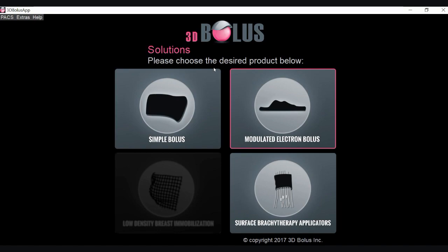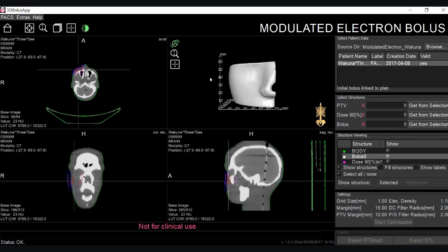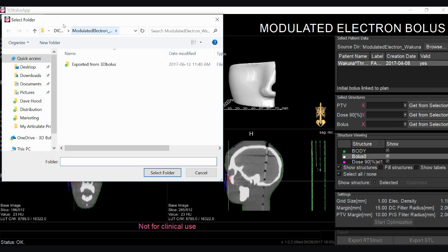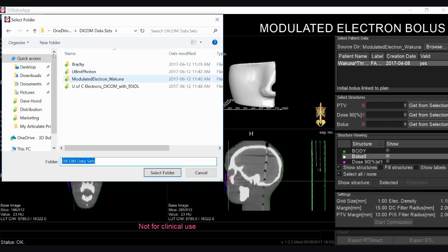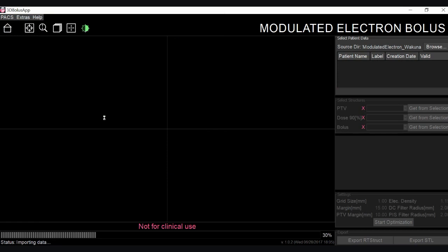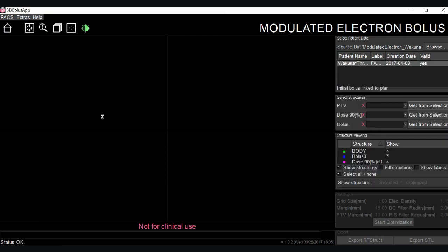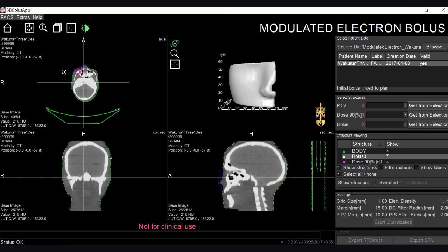Now let's take a look at the modulated electron bolus module, which allows users to reshape the bolus to allow the isodose line to conform to the PTV. Keeping consistent with the simple bolus module, we can browse for our patient information. Our modulated electron bolus module imports the CT scan from the CT simulation, the RT structure set from the treatment planning system, as well as the RT DICOM plan information also coming from the treatment planning system.